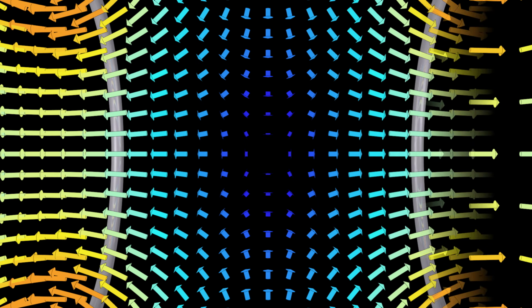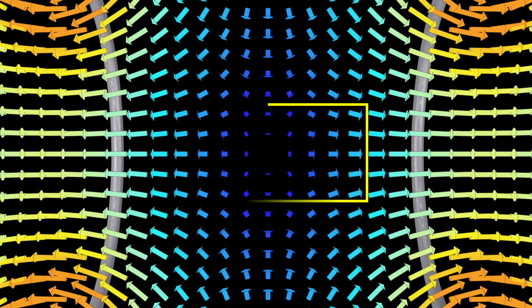Zooming in and filling out the space with magnetic field vectors, we see there is a small volume where a linear magnetic field gradient in the Z direction is created. Field is increased at one end of the volume and decreased at the other. I'm drawing the actual magnetic field of this 2-loop cartoon, so it's far from perfect, but real-life Z gradients are designed with this principle in mind and create much more accurate gradients over a much larger imaging volume. And this 2 coaxial loop design is called a Maxwell pair.